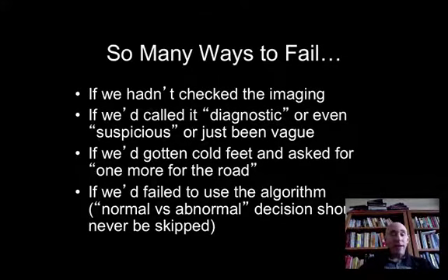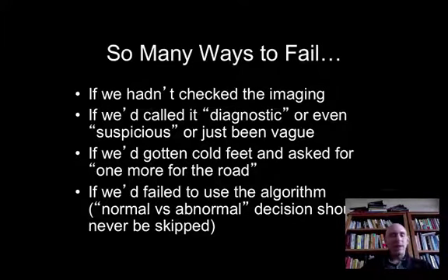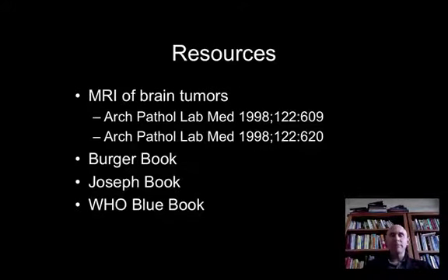Finally, if we hadn't made that first critical distinction, if we hadn't said, when making the distinction normal or abnormal, I can't call this abnormal. If you jump over to just the presumed notion that it's abnormal, you're really doing a disservice, because neurosurgeons are people, and stereotactic equipment does fail. It doesn't always put them in the right position, and even the best neurosurgeon has been in this position. So where they're giving you non-diagnostic material, help them out, be strong, and try and enjoy the process. It's a great deal of fun.